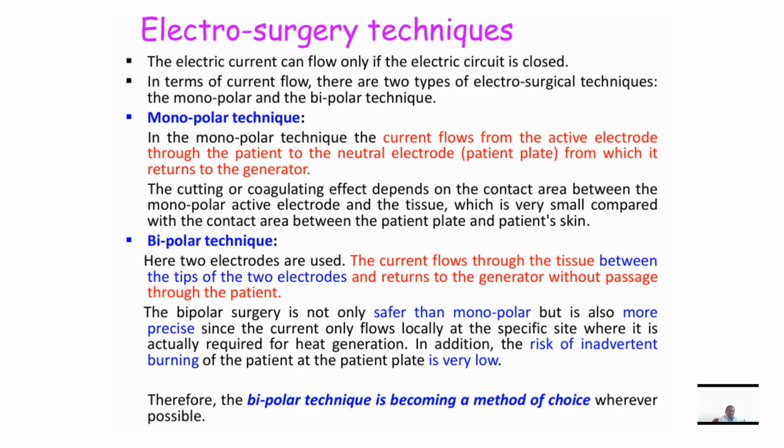The cutting or coagulating effect depends on the contact area between the monopolar active electrode and the tissue, which is very small compared with the contact area between the patient plate and the patient skin.